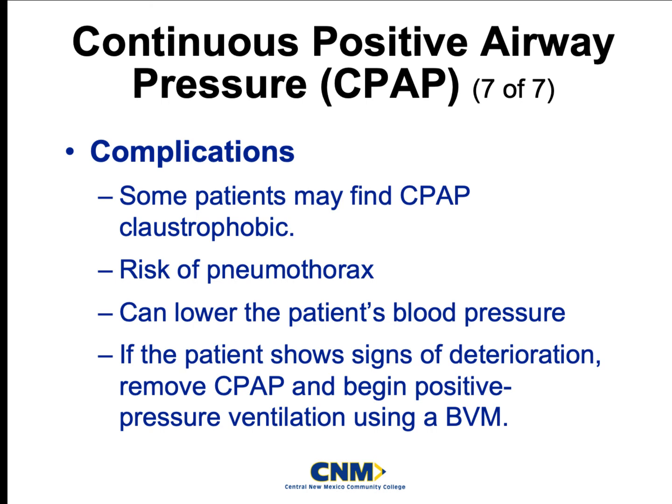Here's the other good news: most of the time the actual mask that you're using for the CPAP is interchangeable with the BVM. So if you see your patient deteriorating and you already have this mask hooked up to their face and strapped down, guys, just remove the CPAP machine, leave the mask on their face, hook up the BVM, and start bagging. You have a way of holding a seal because you have already created that seal with the CPAP mask, right? This is just kind of tricks of the trade, guys, okay? Work smarter, not harder.